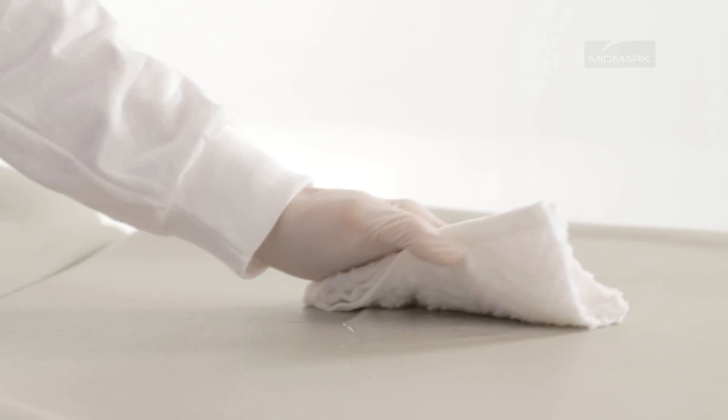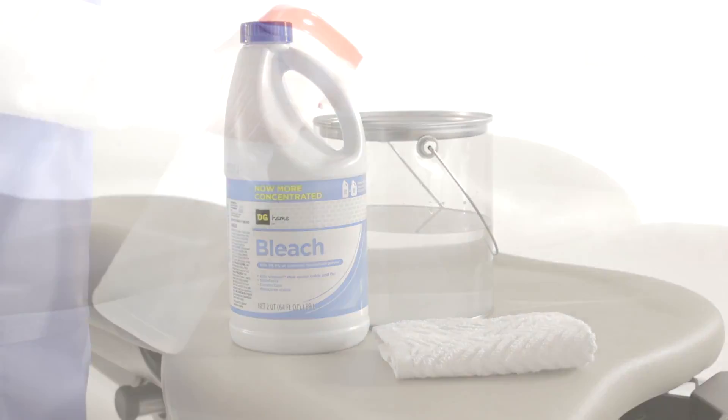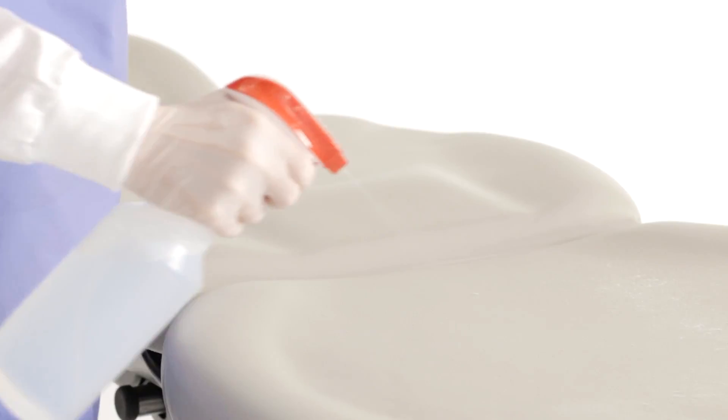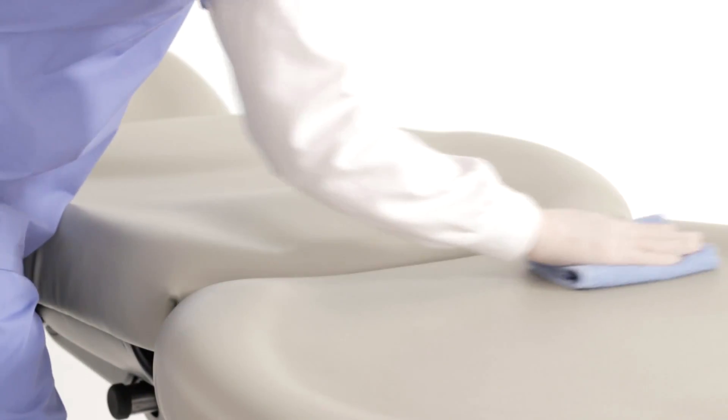Immediately remove any spilled fluids. To disinfect your MIDMARK upholstery, we recommend using a 10% solution of bleach and water as recommended by the CDC. First, position the table in a flat position. Disinfect, rinse with clear water, and wipe with a clean towel or cloth.